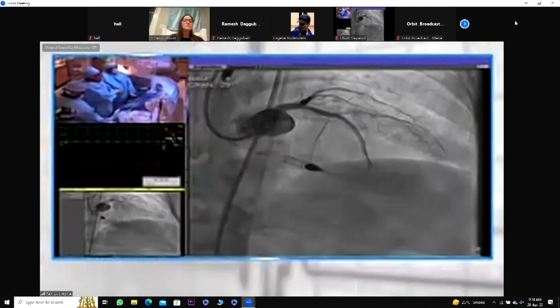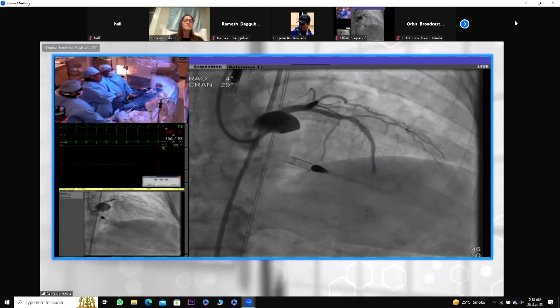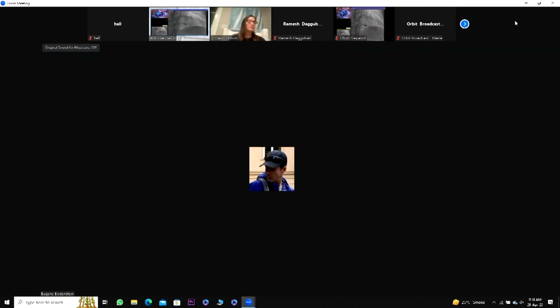Maybe you need some post-dilatation in the mid-LAD stent, as you are already planning. Correct. Otherwise, the results are good in the mid-LAD stent, and I think I'm happy with the left main and the proximal, but we'll hit up the rest of the LAD and then we'll IVUS.